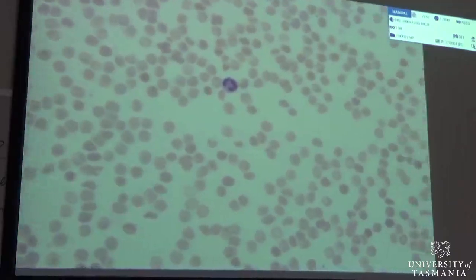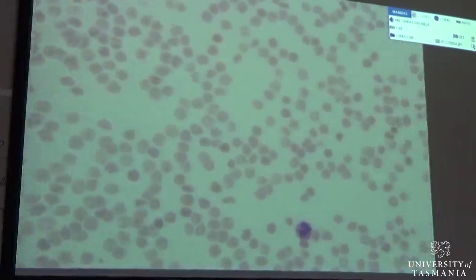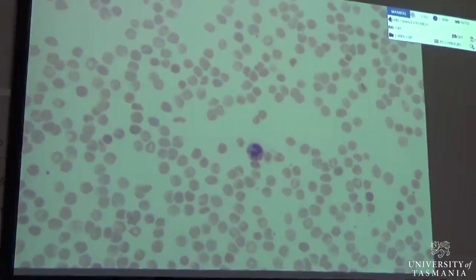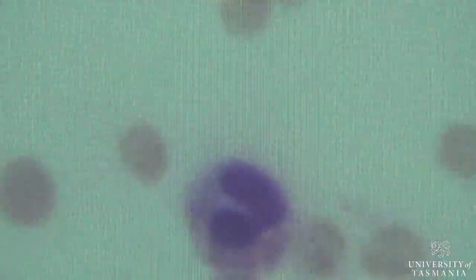There's a lot of viruses that affect the liver and attack the liver. So these cells are looking a bit more toxic. And again, can you see the really dark granules in that neutrophil? Yeah, I had a few that I was pretty sure were toxic. Yeah, so there are a couple of toxic neutrophils around, although they're not mentioned here.